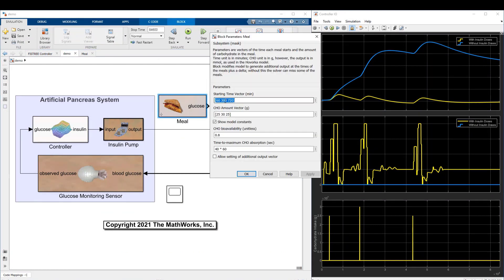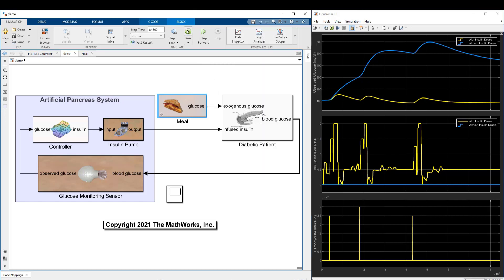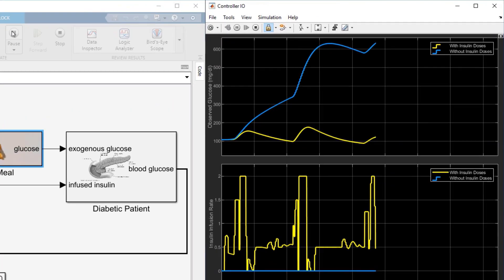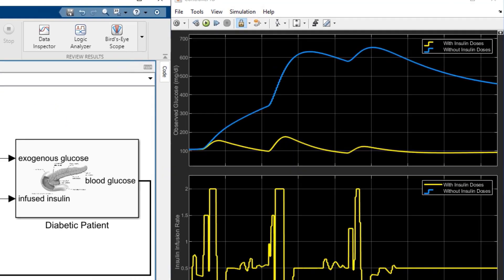For example, change the second mealtime to 360 minutes, which is the 6th hour of the day, and change the corresponding carbohydrate intake to 50 grams. Then run the model. The final glucose level up to the third meal is still below 100 mg per deciliter.